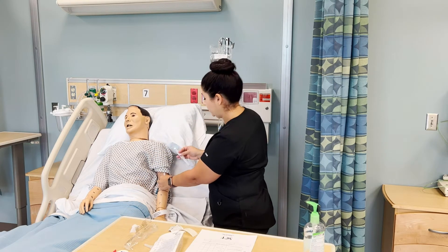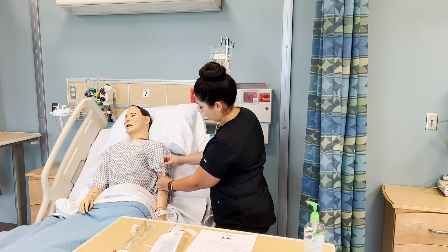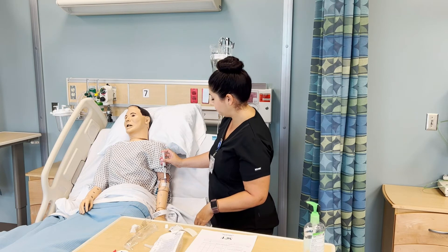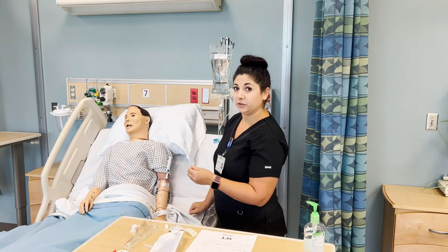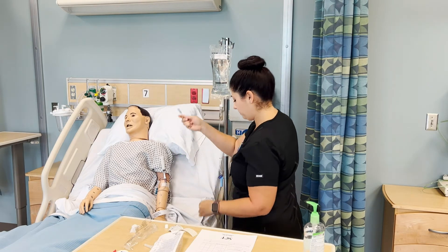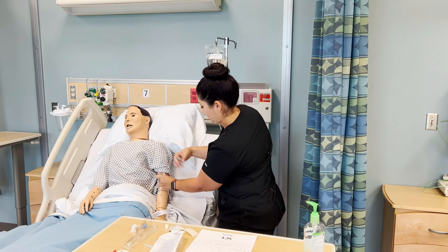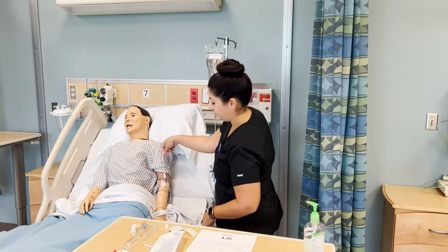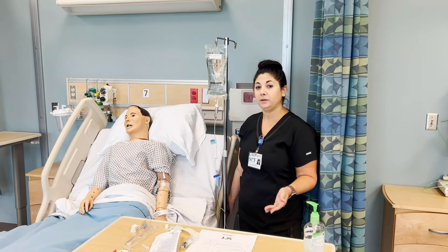Keeping this in your hand so it's not dropping onto your patient. I'm going to remove the cap, keeping the tips sterile. Slowly inject the flush and assess your patient, making sure they're not in any pain — should do at least three to five milliliters. We can leave that right there or we can take it off, making sure that it is in our hand the entire time so that it stays sterile. Grab our IV tubing, go ahead and take this cap off, maintaining the sterility of this tip. Remove our flush very carefully, twist that on, making sure you're not touching either of those tips. At this point we want the patient to be in the position that they will remain while our fluids are going.